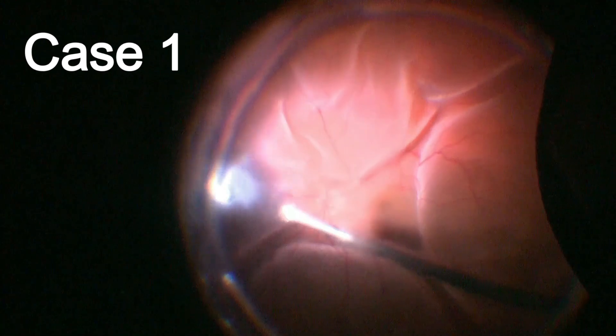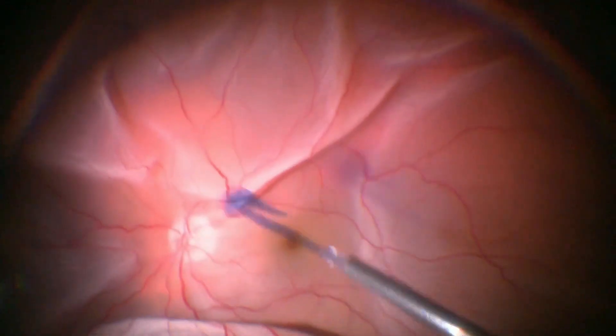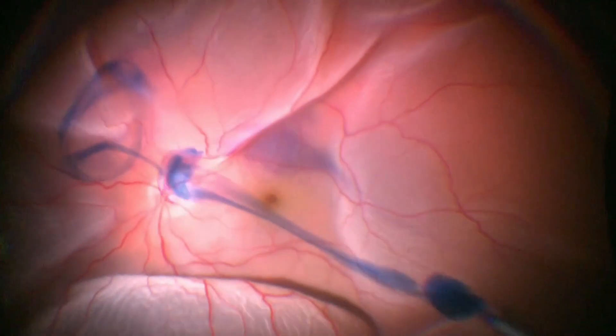This is a case of bullous retinal detachment with macular hole. After doing vitrectomy, staining of ILM with brilliant blue dye was done.